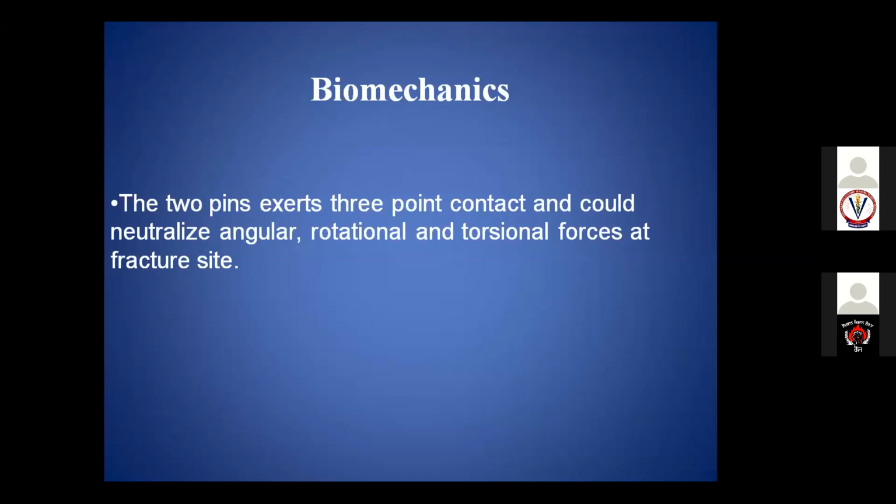So the advantage here is they can counter angular bending forces, rotational forces, and torsional forces. So it is better than using a single intramedullary pin. The procedure is dynamic intramedullary pinning.